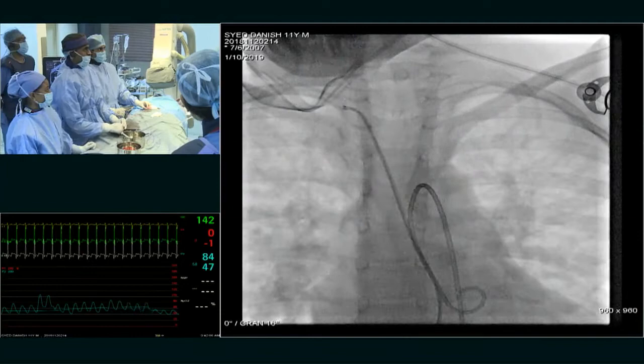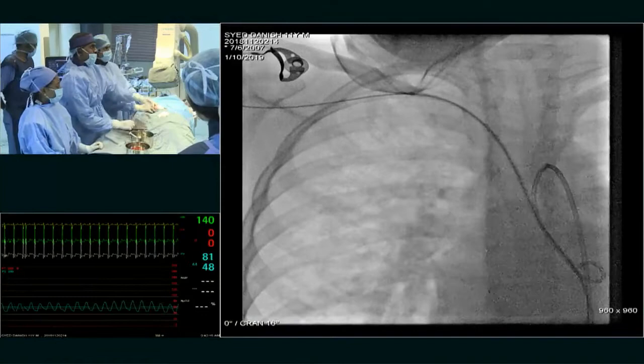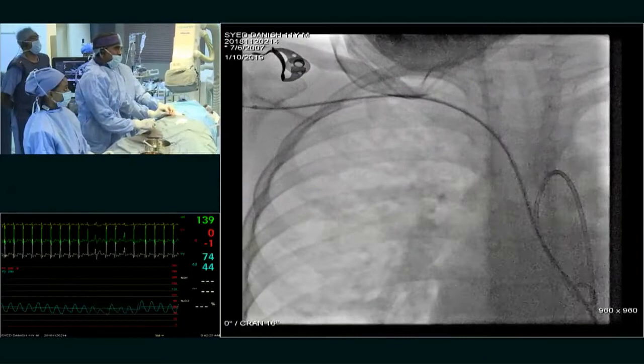Stiffer up there. I'm planning to enter into the subclavian now. So once I'm into the subclavian, since it was an 8 millimeter AP window, you also saw that the pulmonary artery pressures were pretty high. So we are using a 12/10 PDA device.